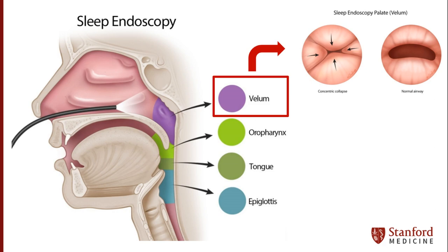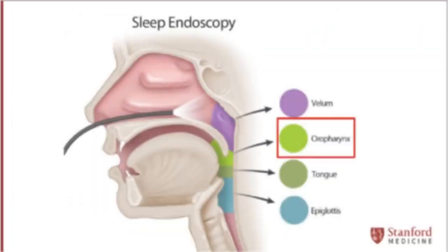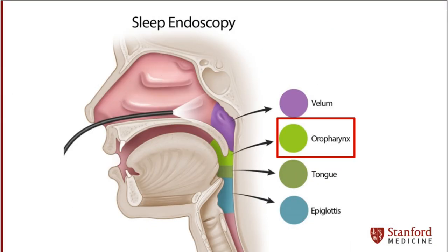From here, the scope is positioned in a rostral view facing towards the larynx, also known as the voice box, to best visualize the velum as sedation is infused. After observation of the velum is complete and the degree of obstruction is noted, the scope is then passed distally to observe the airway at the level of the oropharynx.